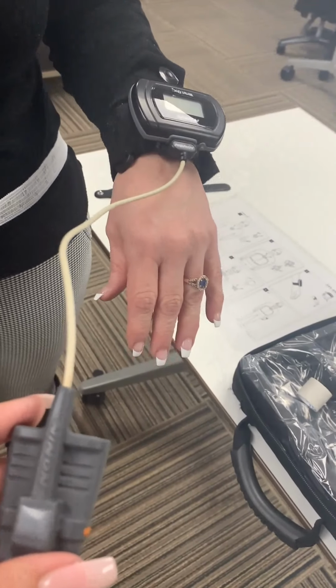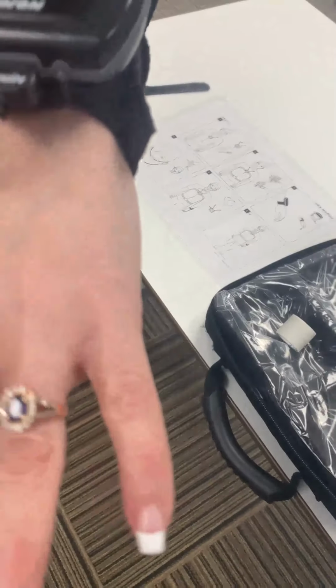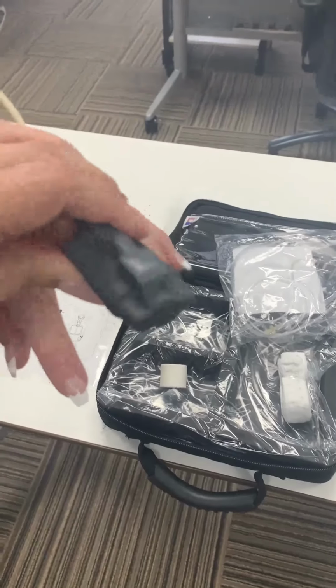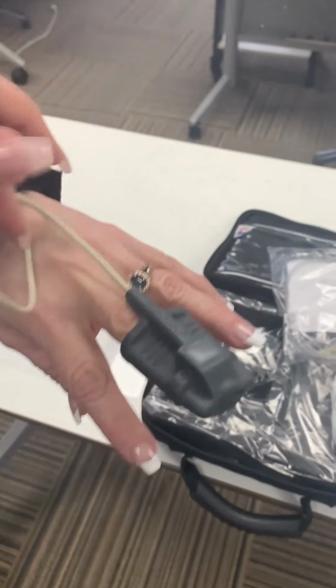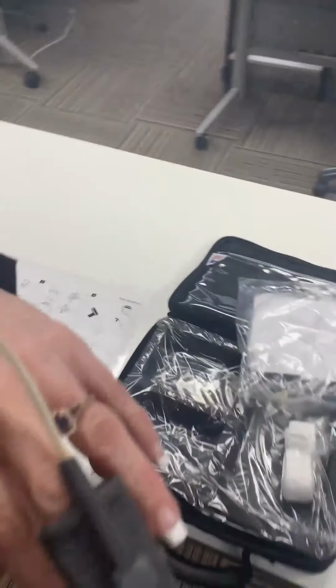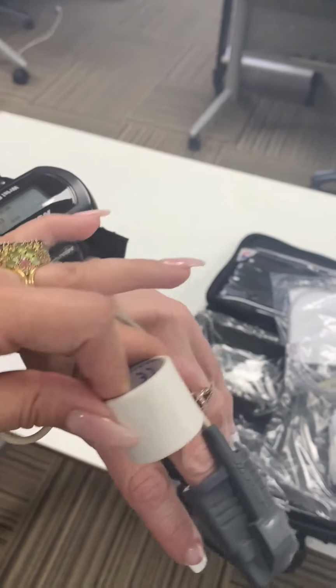It goes on your non-dominant hand, and you wear it like a watch. Slide the finger probe so that you can see a little bit of your fingertip, and the wire has to be on top. We have provided medical tape to tape and secure the wire.